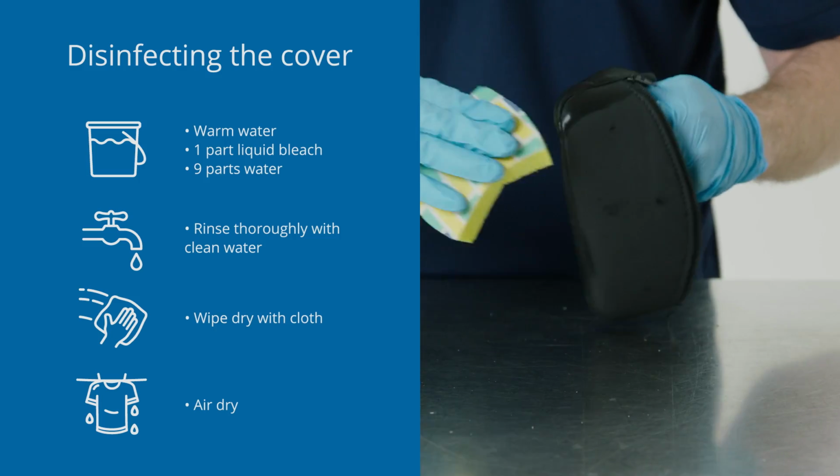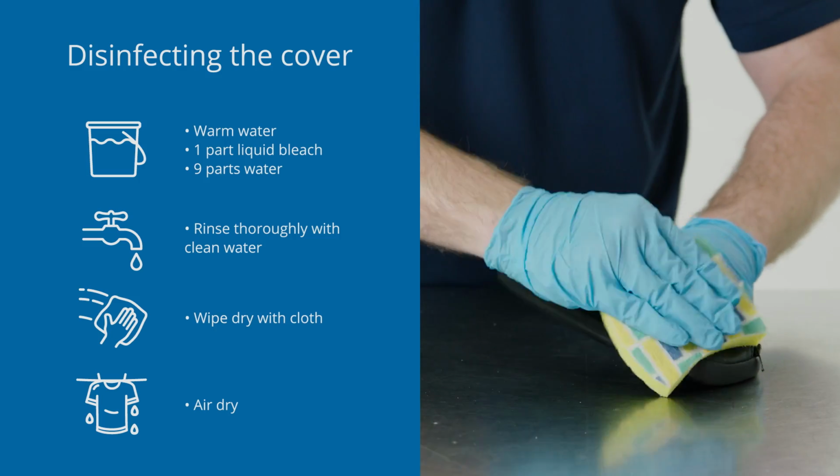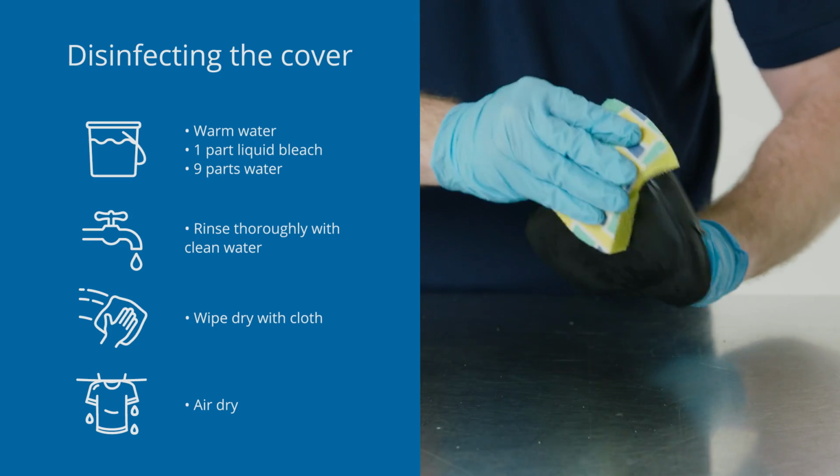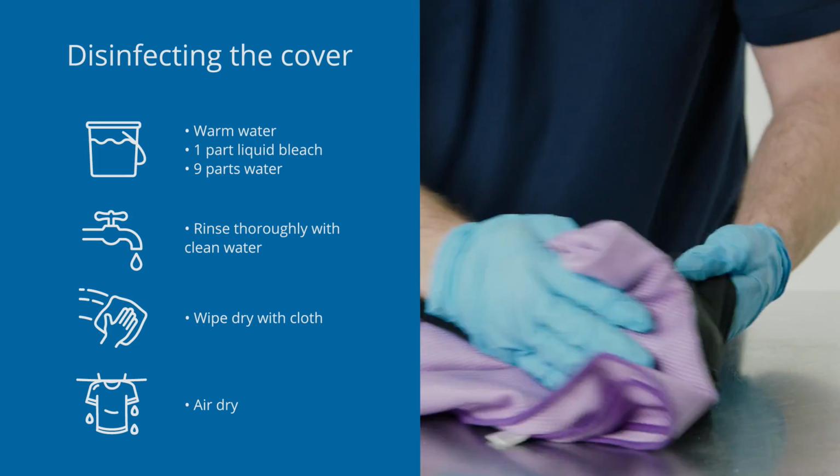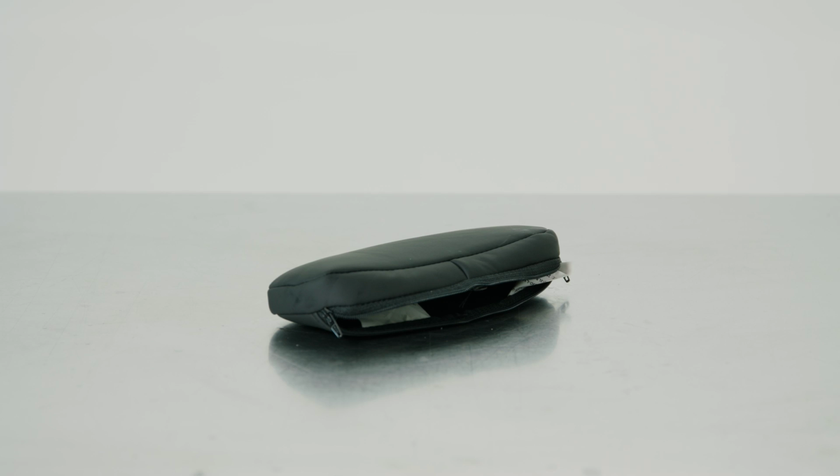To disinfect the cover after cleaning, hand wash in warm water using 1 part household bleach per 9 parts warm water. Rinse thoroughly with clean water and allow to air dry completely before use.